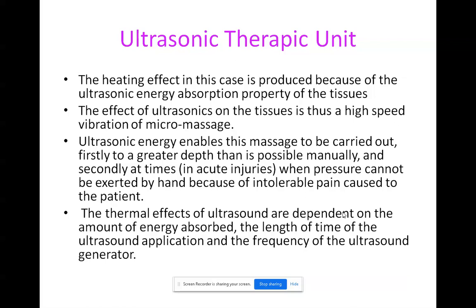what will happen, it will not give that much effect, and it will create pain for the particular part when you are using massage at the injury time.